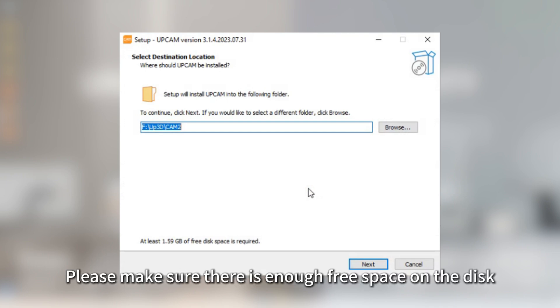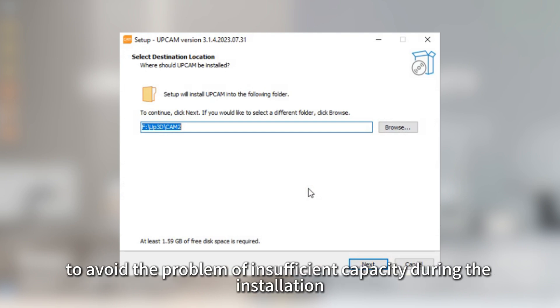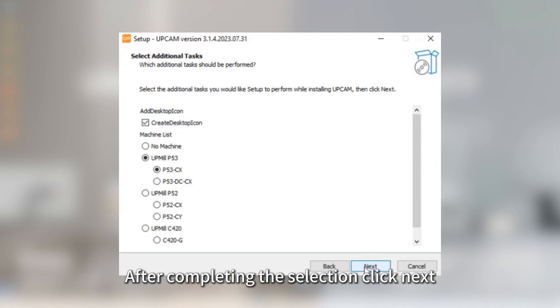Please make sure there is enough free space on the disk to avoid the problem of insufficient capacity during the installation. After completing the selection, click Next.